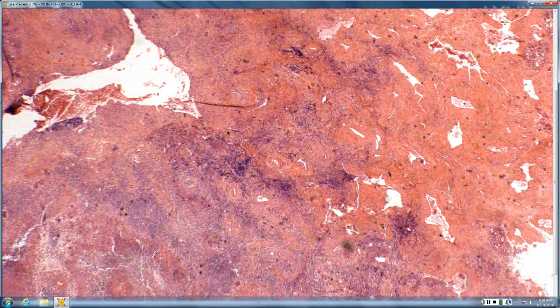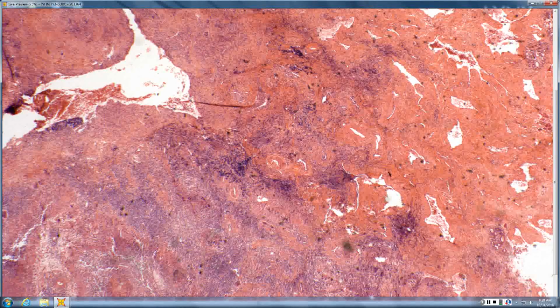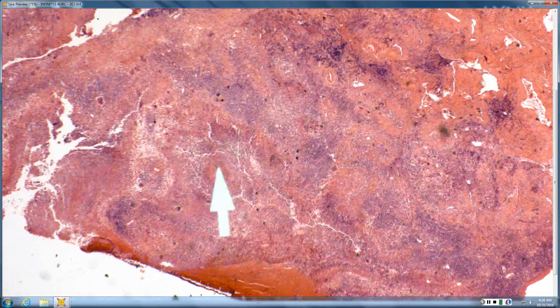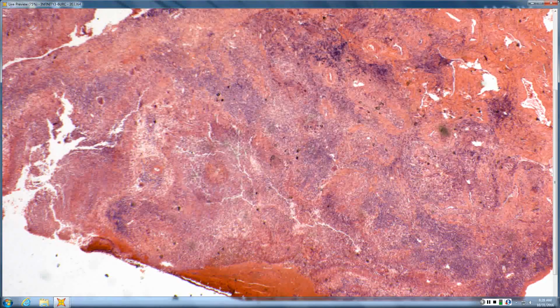And then we've got to get to clinic, so this is our last one. Looks like a palisading granuloma almost. Actually, we're going to do two others lightning quick. So you see palisading granuloma with neutrophils in the center, and you are on erectile tissue with glands.